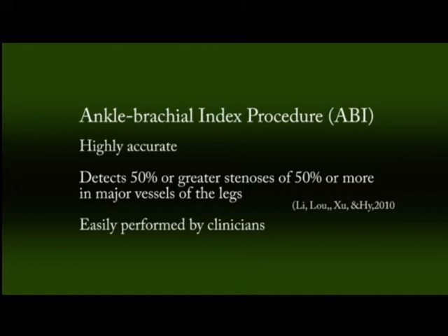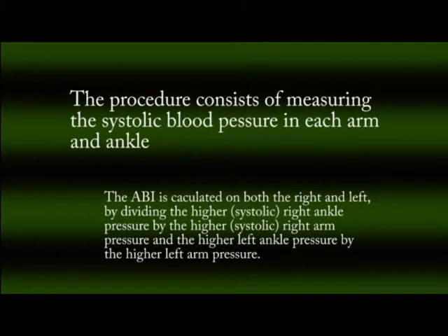A simple procedure used for determining if a patient has PAD is the ankle brachial index. This is a procedure we will be doing in the clinical laboratory today. Let me give you an example.